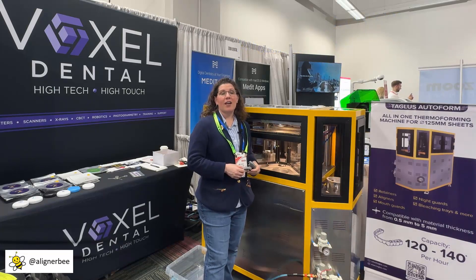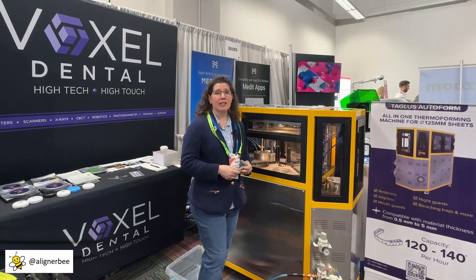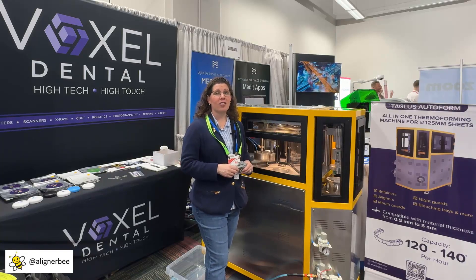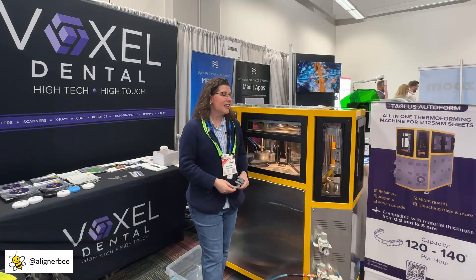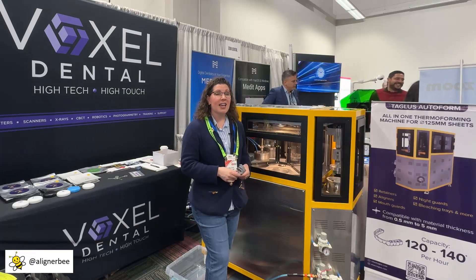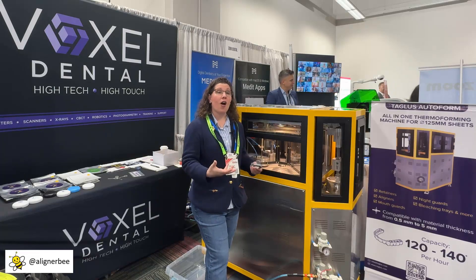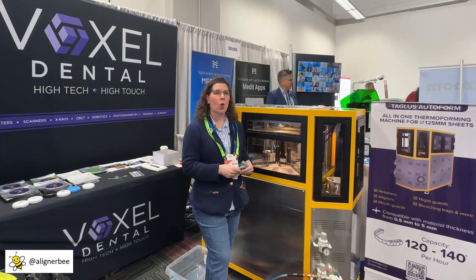One of the things that I encounter in my lab, and I know a lot of doctors encounter both in their in-office lab and in small commercial laboratories, is the time that it takes to vacuum form our in-office clear aligners. I'm here at the Voxel booth with Taglus to see their new automated vacuum forming machine. This machine is designed to use disks instead of the roll material for offices that are smaller and aren't quite ready to have the production of using rolls.